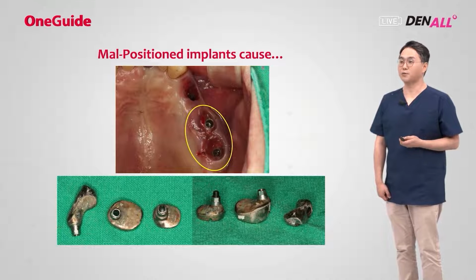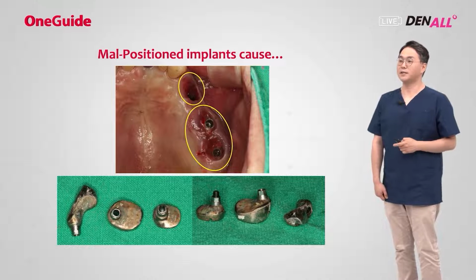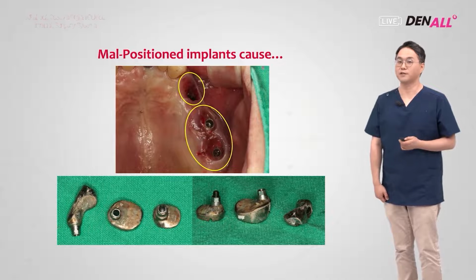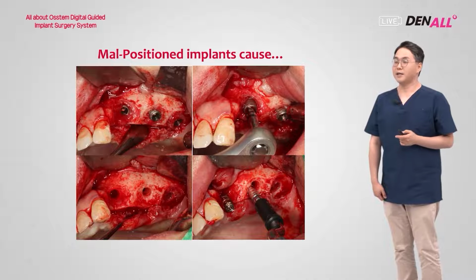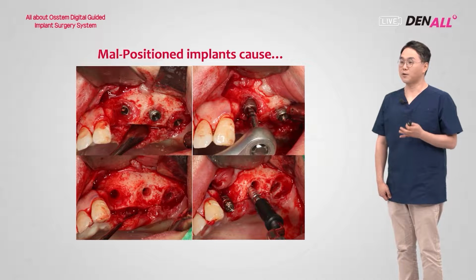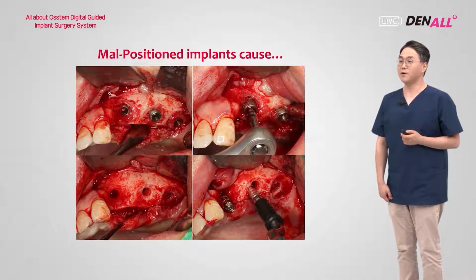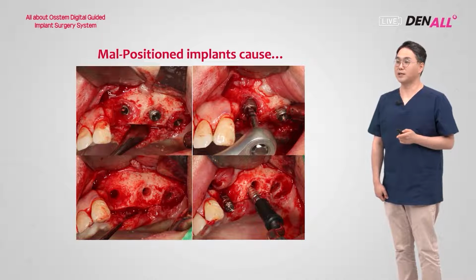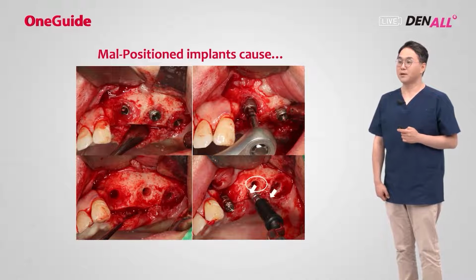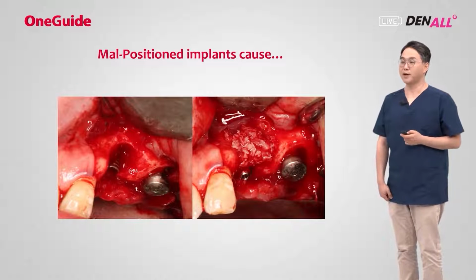If we remake a crown and do the prosthesis, will we be able to solve the issue? No. I talked with the patient again and decided to remove the implants. I removed all 3 implants placed, and because it was the maxilla, I did not use the EFR kit and used a fixture driver and taper kit and reversed them out. To place implants in a good position, both buccopalatally and mesiodistally, drilling was done again towards the palatal. An osteotome was used to lift the sinus floor, and 3 implants were placed in good positions.